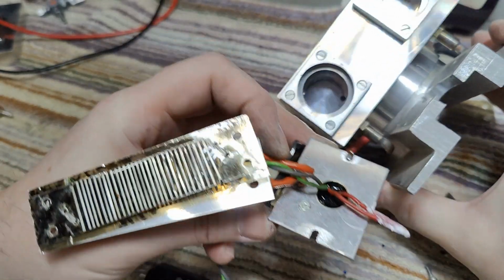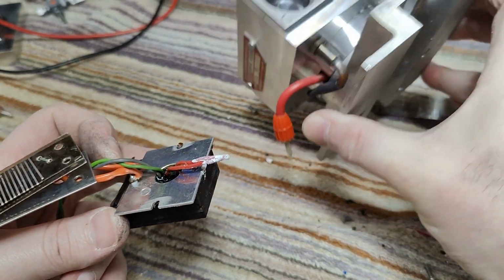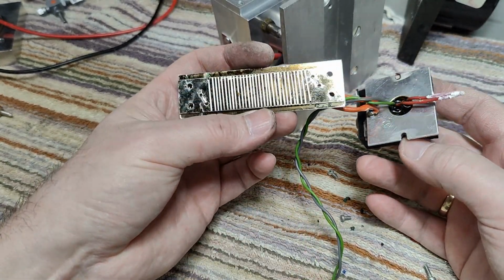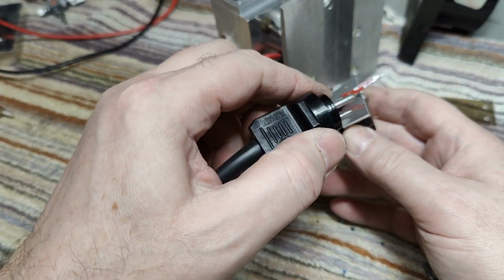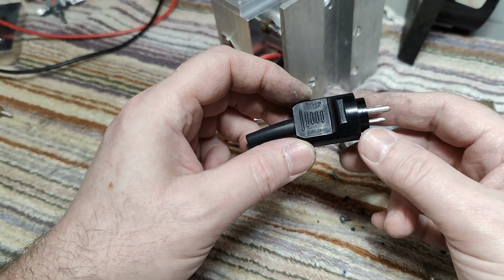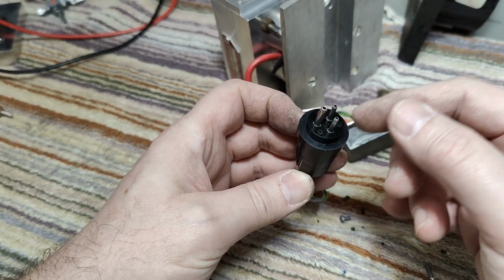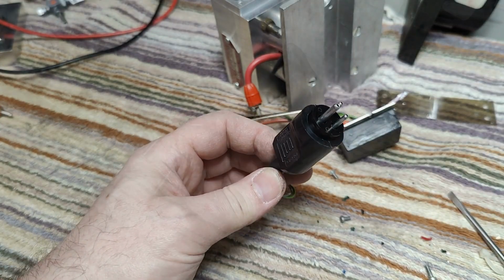So here is the important stuff. There's a little temperature sensor in that hole here at the bottom of all that stuff. So this little unit here is a little temperature controller in a little rubber. Oh, look at that. I was a little bit lucky to find one of these. The 3-pin Bulgin connectors. They are quite rare, by the way.